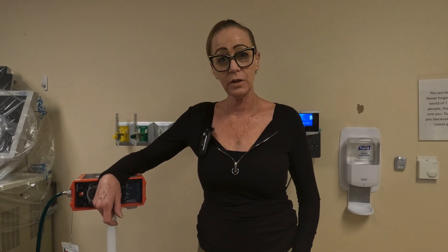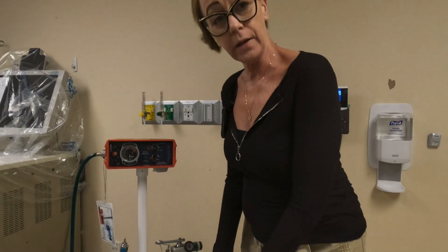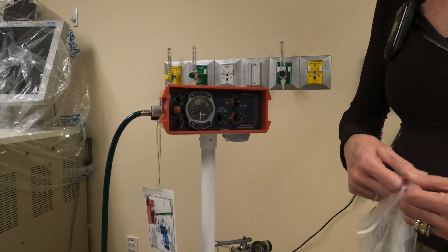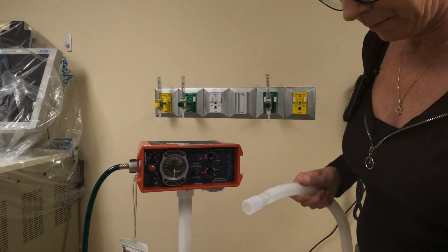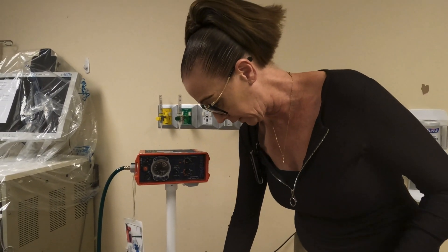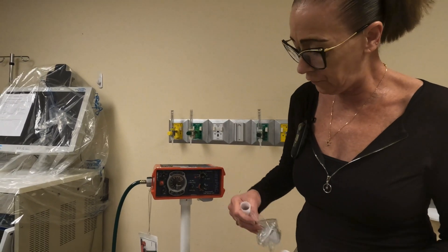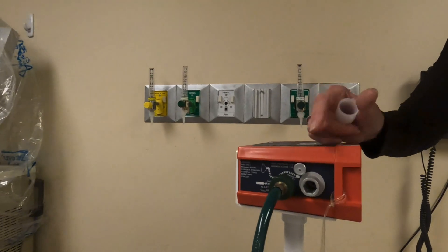Hi, my name is Michelle and I am here to show you how to set up and use the Para Pack transport ventilator. First we are going to get our circuit set up on the machine. Sometimes, depending on what circuit we receive, we have to use a couple of adapters in order to get the circuit to hook up with the filter on the port, which is located here on the side of the machine.